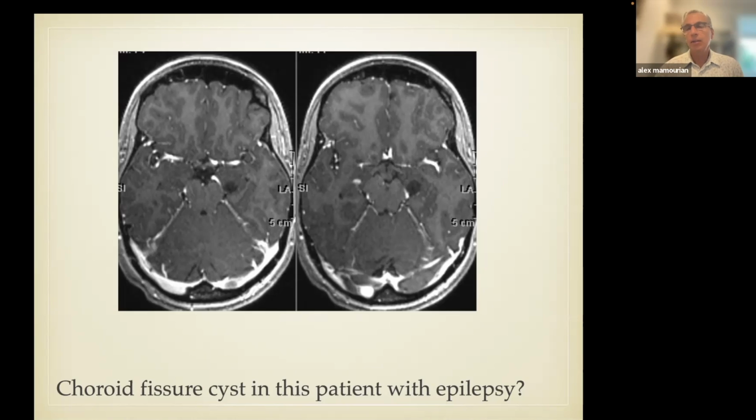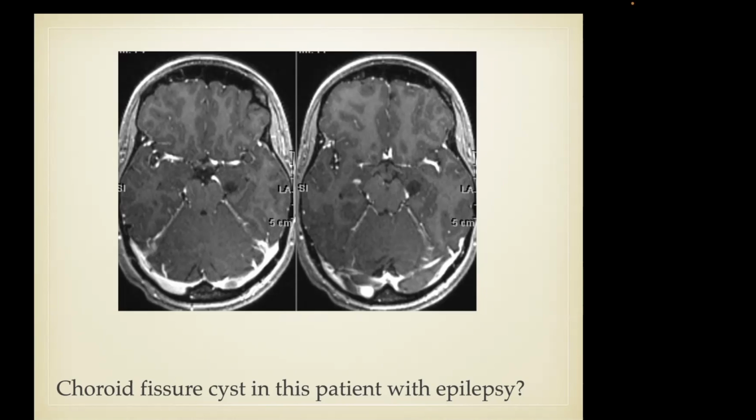That's a pulse sequence that I am very familiar with, and I think it's very effective in showing the abnormal leptomeningeal enhancement. The reason is that fat suppression has a magnetization transfer effect, and it decreases the signal of the brain and maximizes the conspicuity of the enhancement. But again, please send me that article. Thank you very much.